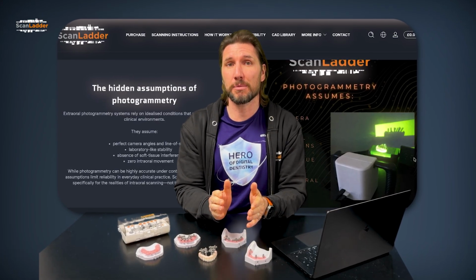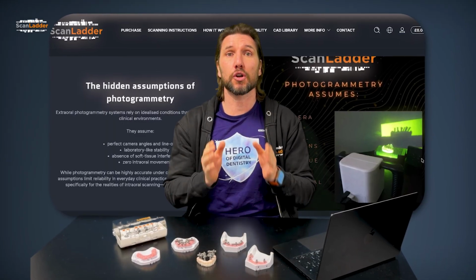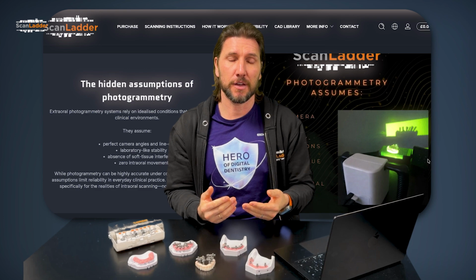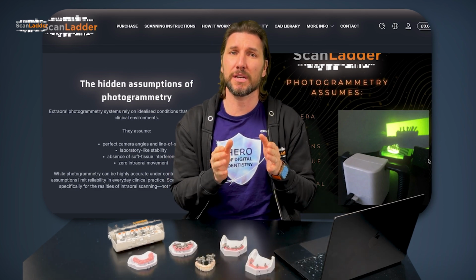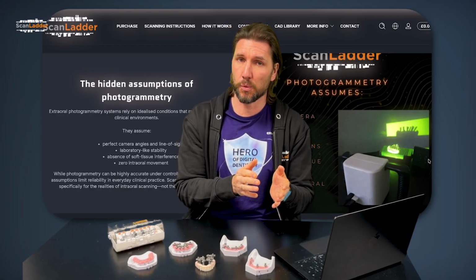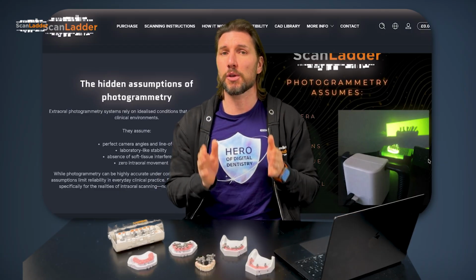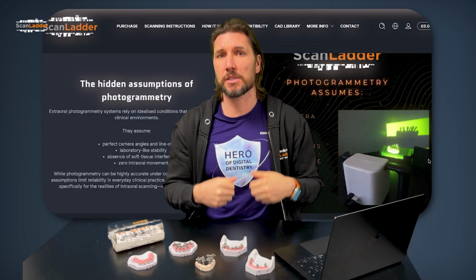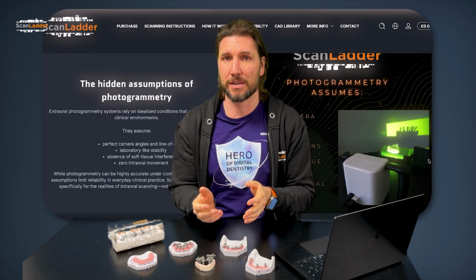Well, photogrammetry really assumes that you can see everything in the frame and look at everything in one go all the time. But in real life, patients aren't always easygoing. It isn't always an easy scenario that we're using photogrammetry in. The tongue can get in the way, the lips can get in front of scan bodies, and that can mean that really without line of sight, we have to move things around, and it presumes stability that is easier in mind than it is in practice.